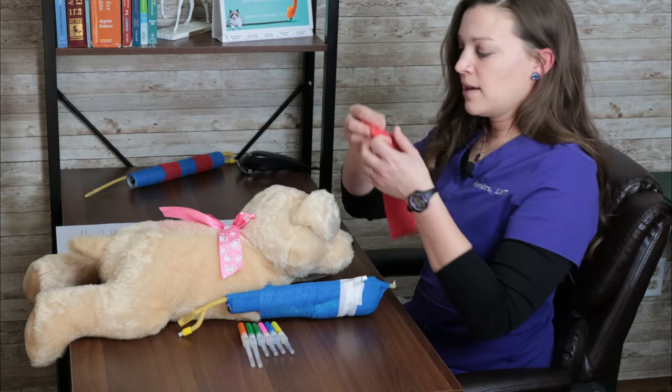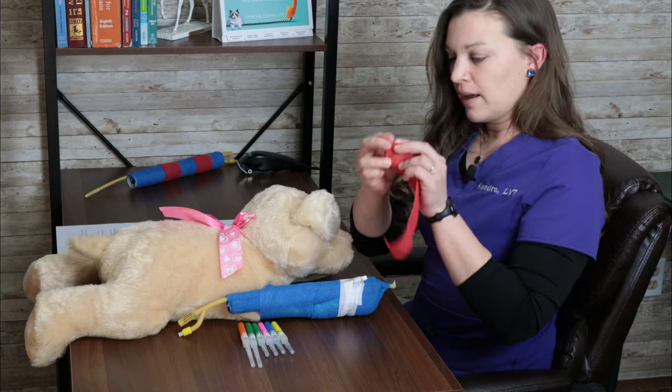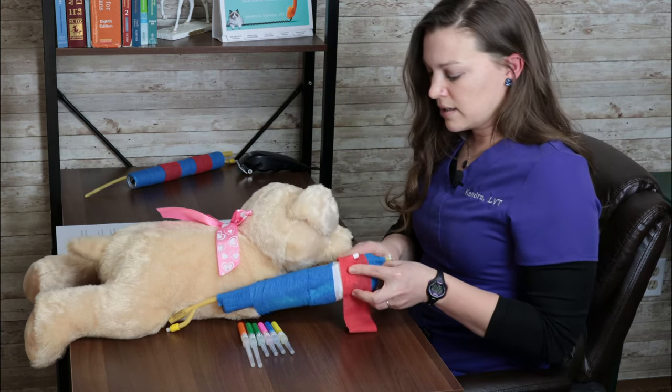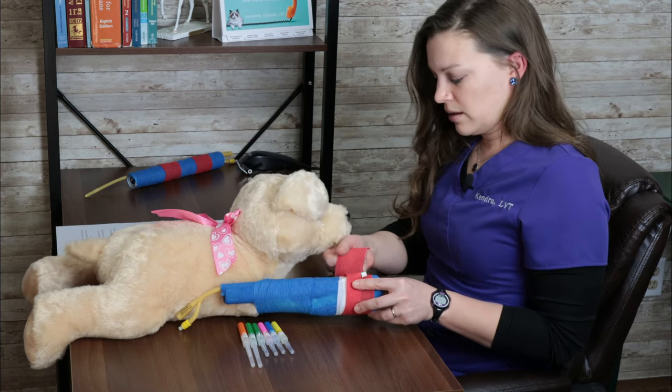The final step is the vet wrap over. I like to cut a little hole in it to put my cap through so that I always have a nice clean surface here to work with.